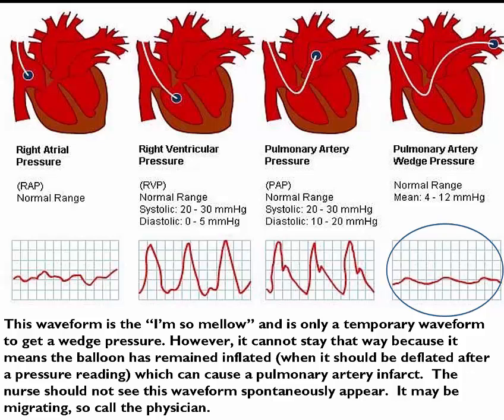This waveform is the "I'm so mellow." It is only a temporary waveform to get a wedge pressure.